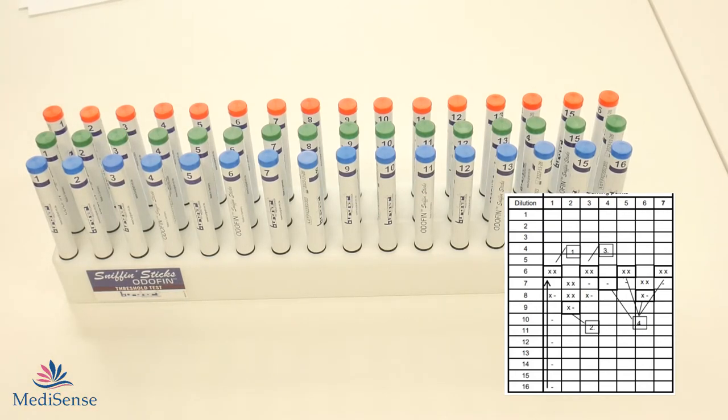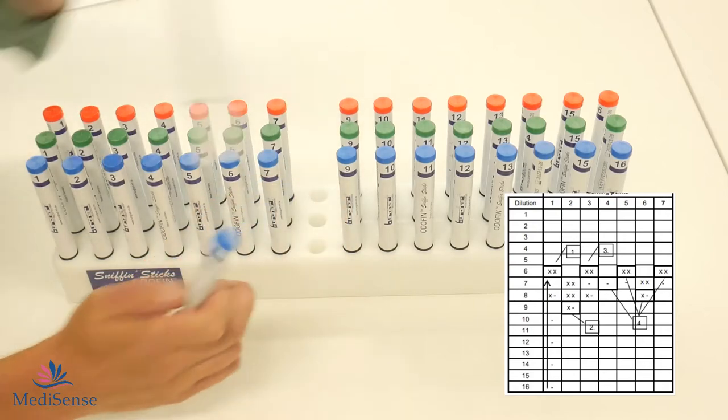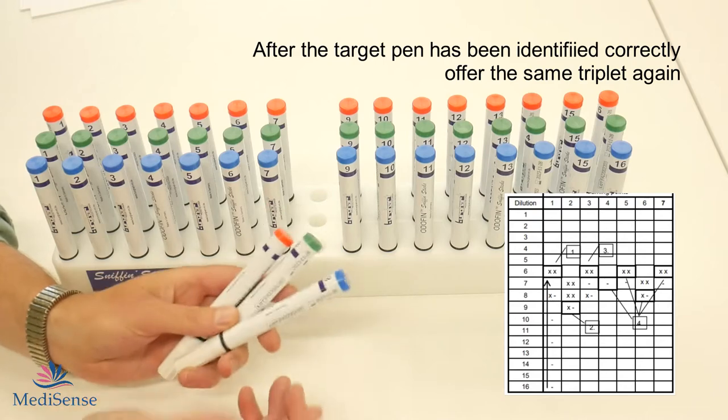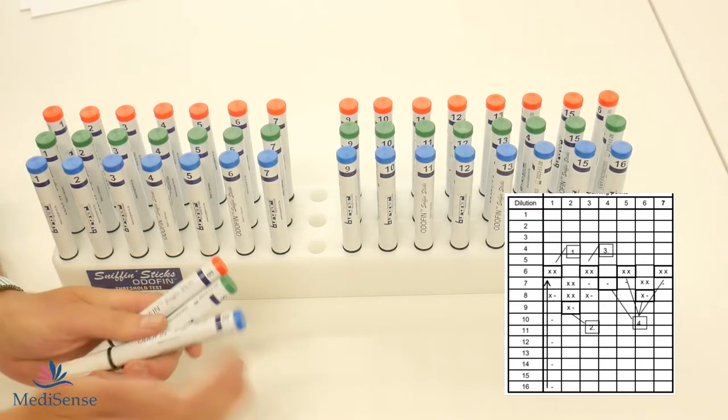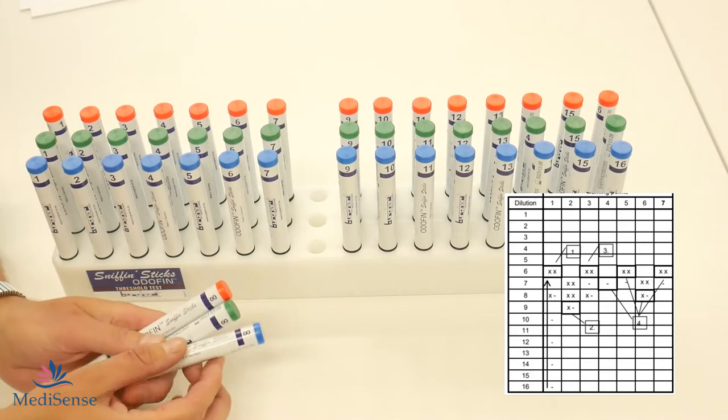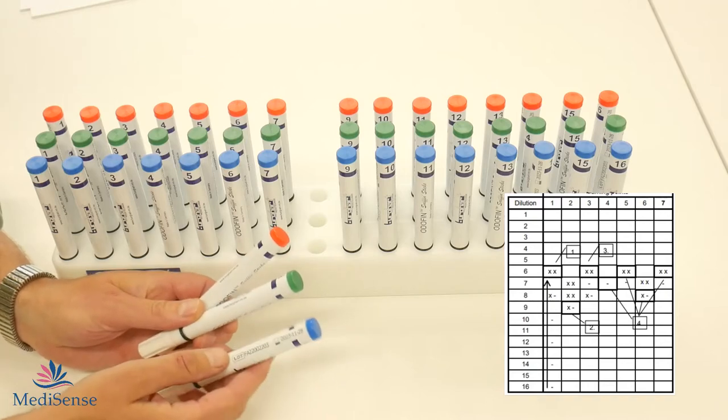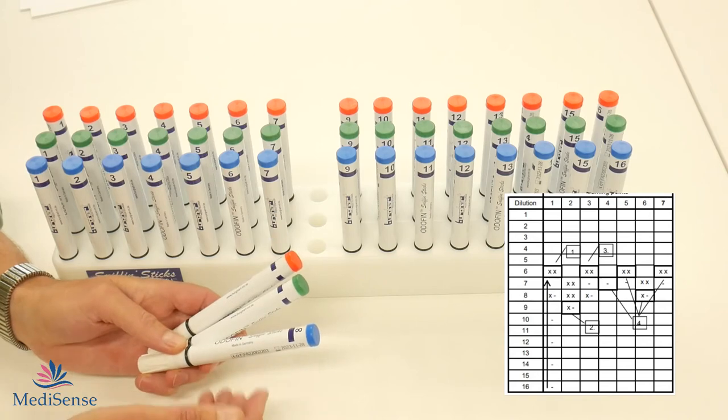In the manual there is an example of the test procedure and there you can see that the first round number 8 is guessed right. If the test person identifies the target pen correctly then after that you offer the exact same set of pens again. So in the example it is number 8 which is guessed right then you offer the number 8 pens again.